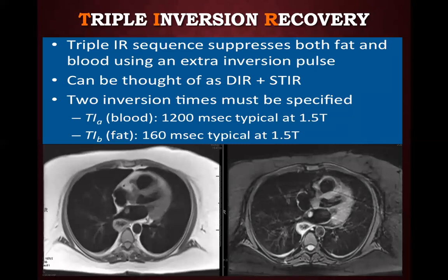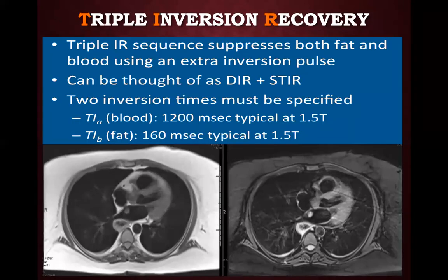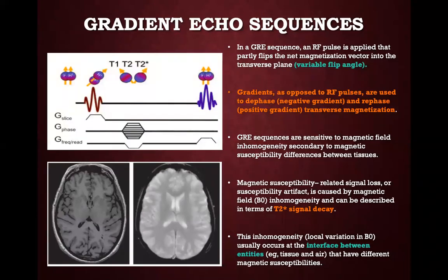What is triple inversion? Please don't bother about it. It's not needed for this. If you invert everything in the brain, you'll have no images left. Anyway, that's not needed for us.